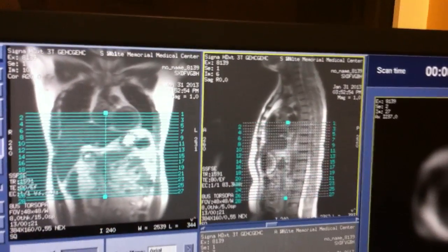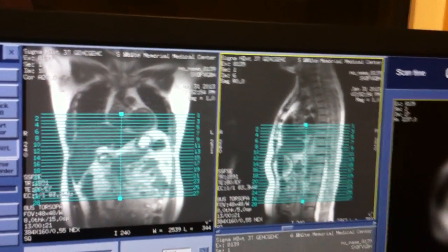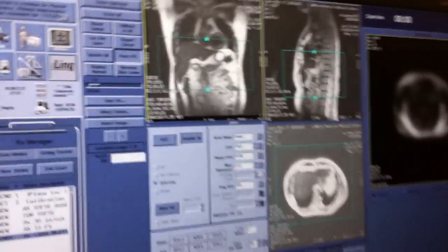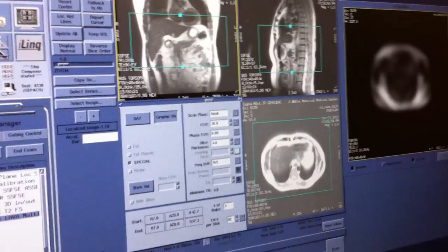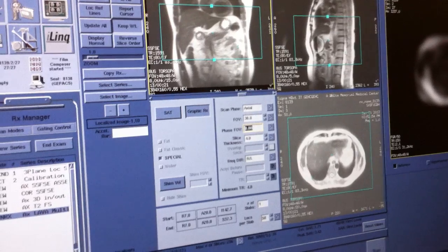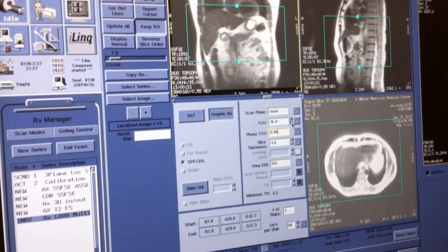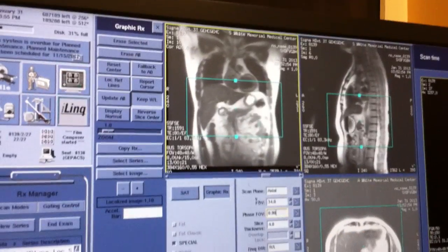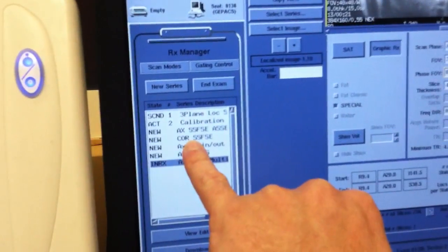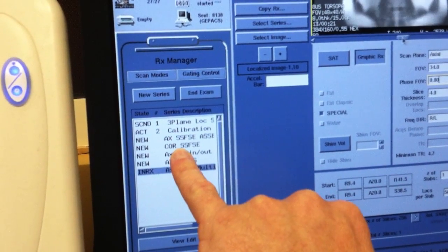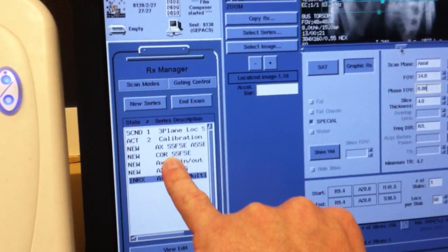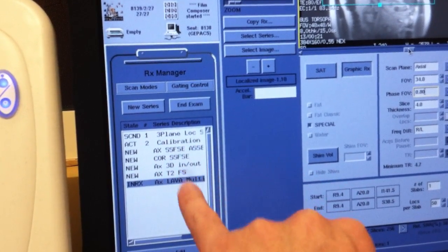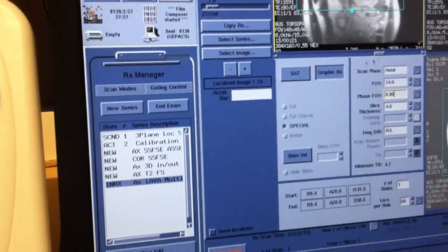If you can use a rectangular field of view, if your patient is thin enough, I would recommend it. It saves you a ton of time. And here's, we're going to run the lava. Now, it's like a 3D scan. You'll notice it's just over the liver. We're going to use a rectangular field of view. In this case, it doesn't have to be so big. And this is how you would plan it. The coronal T2 single slab that we did would be able to see the entire liver. In this case, our 3-plane loc gave us a really good view of it. But this is what I would run if this was a real patient.